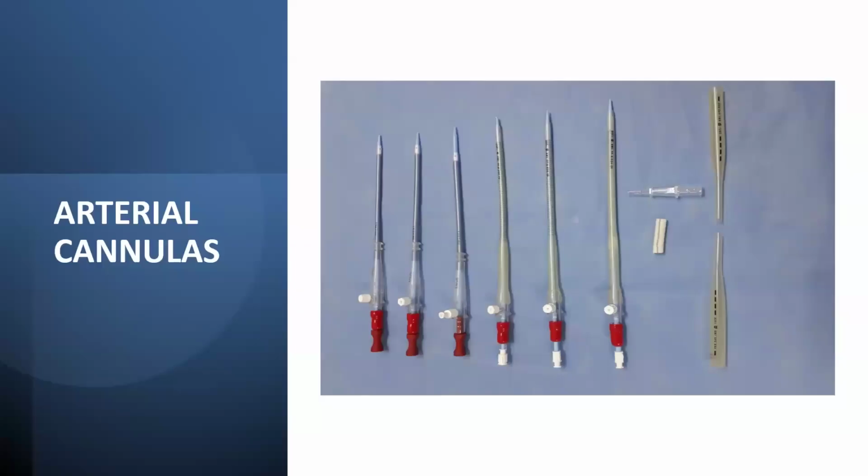So these are the usual arterial cannulas or the return cannulas. It's better to say return cannulas. You have seen that they are smaller in size, they are wire reinforced, and they have a side port for your distal perfusion that we will come to later. They usually have only one or two holes at the tip because we are returning blood through this.